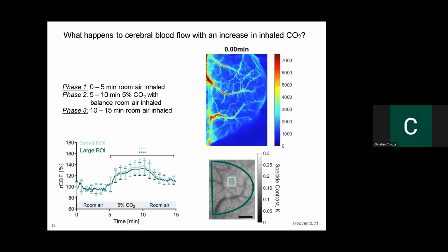Good question. So the exposure time is very important. The question is, what was the exposure time for this data set? For this, we use an exposure time of 10 milliseconds. I don't remember if there's any lab associated with exposure time, but I'll just briefly talk about, well, there's multi-exposure, right? Or no, in your lecture? Okay. So Bernard will get into it a little bit later about the exposure time. But for this, we use the 10 millisecond exposure time, which is important for tuning the sensitivity to flow.